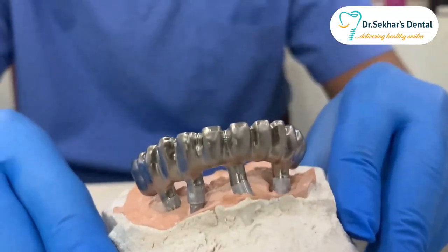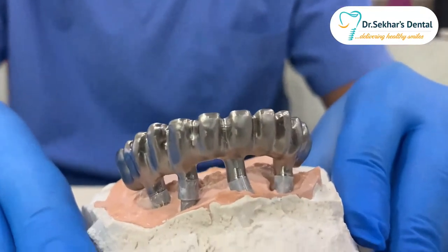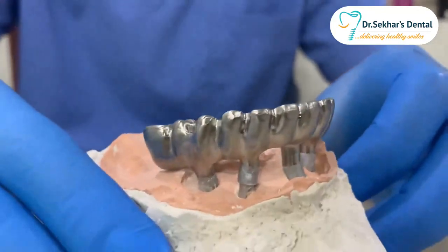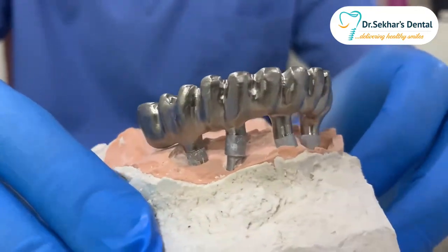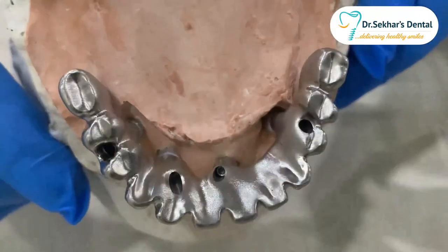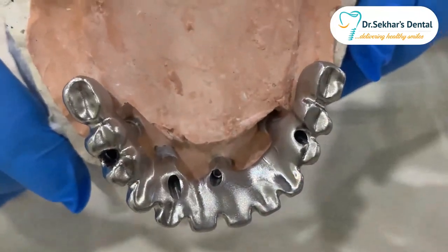The single screw has been tightened and you can verify the accuracy of the frame by all means. It's so perfectly seated without any modification. Thank you.